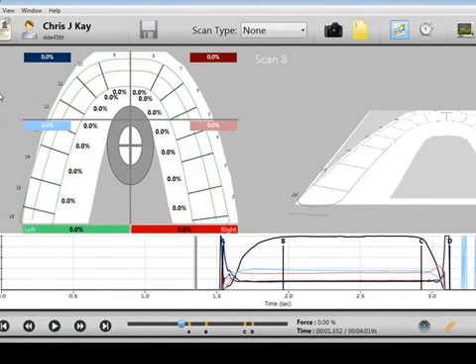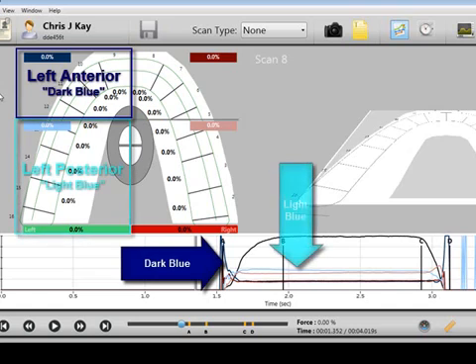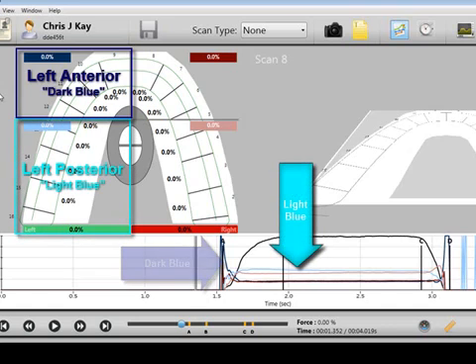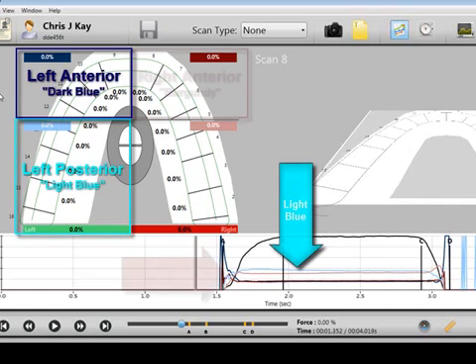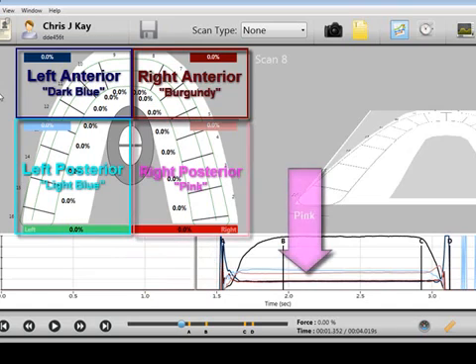Now, the left green and the right red side of the patient's arch is replaced by four quadrant lines representing the patient's left anterior, left posterior, right anterior, and right posterior.